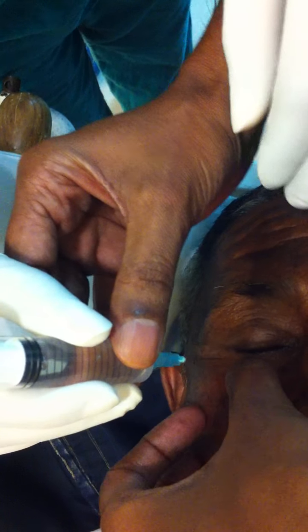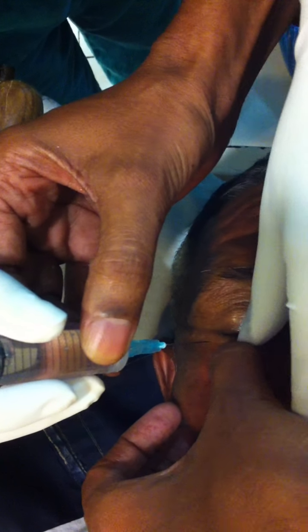So you are going towards the peripheral, right? Like a torch — torch direction. Just a minute. Torch.